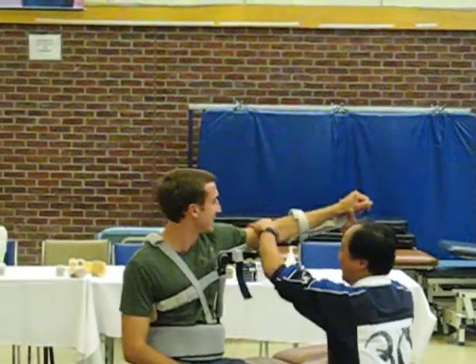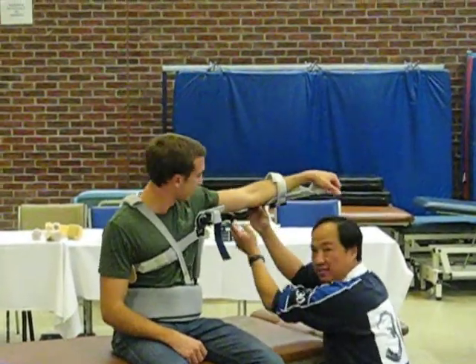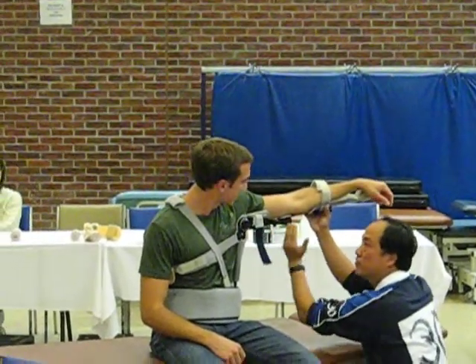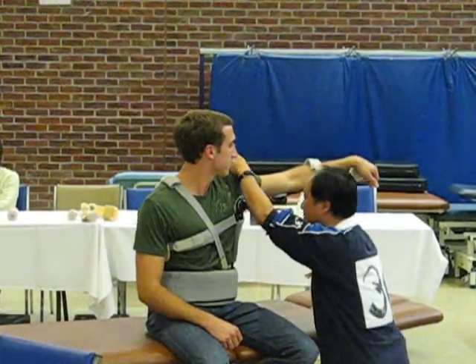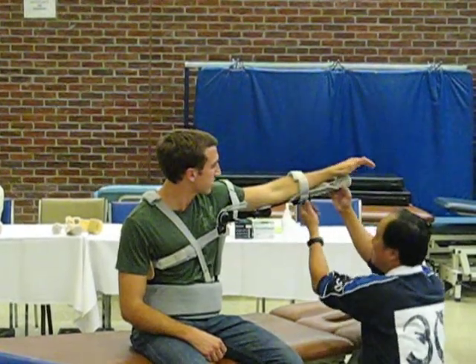The arm is here. Of course, this one we can adjust to the right length. But to save time, here's the adjustment — you can move it to about 15 degrees or something. And then we can strap those. Same as here — this one we can also adjust, but I'm not going to do it now.